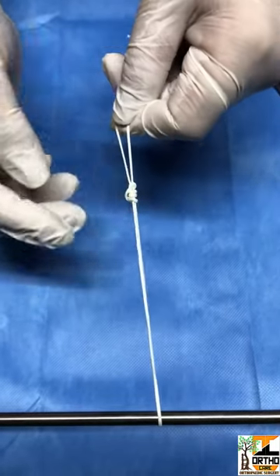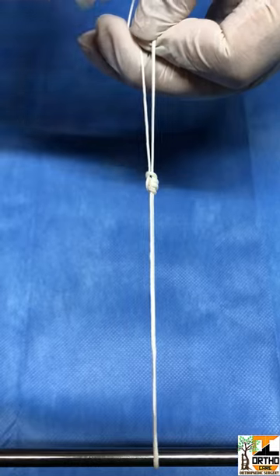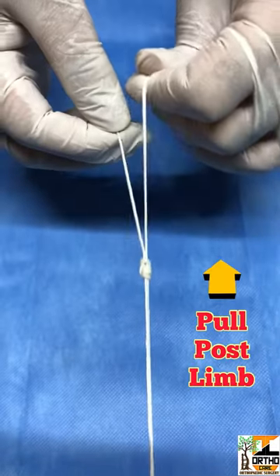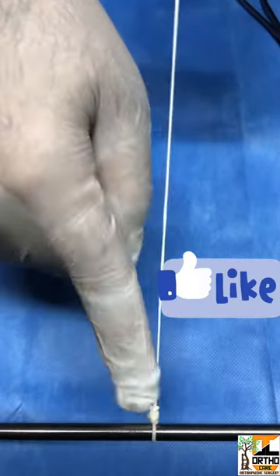Reverse tension it — you can see the nicely formed knot. Now just pull the post limb till it adheres to the tissue.